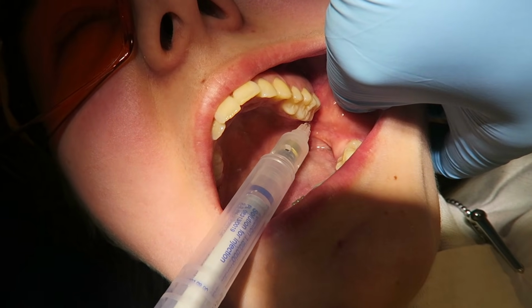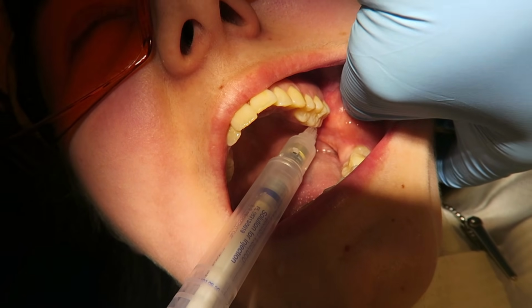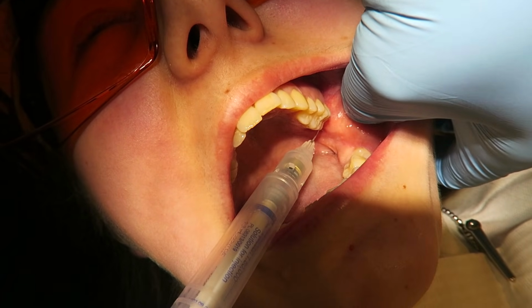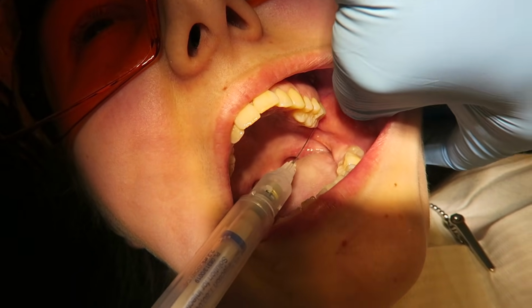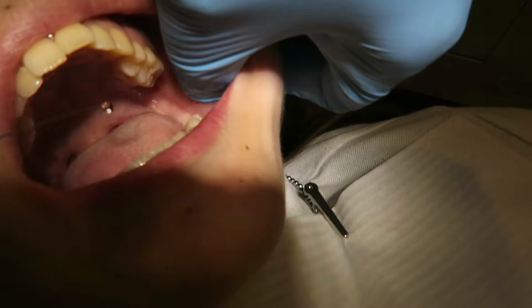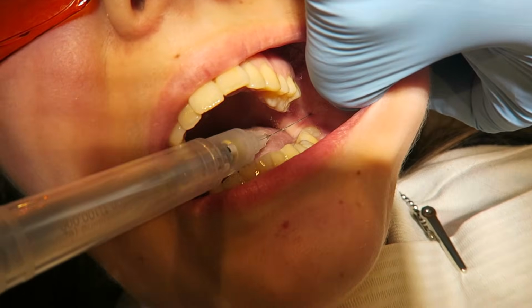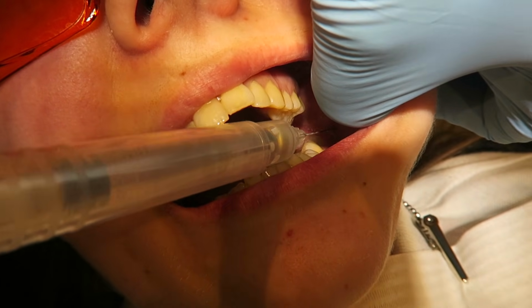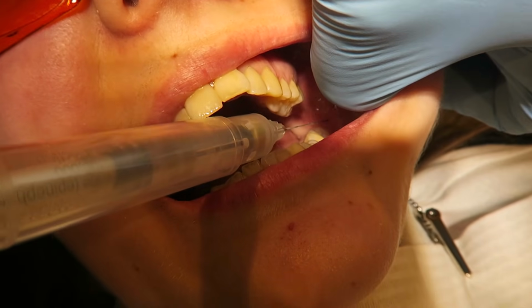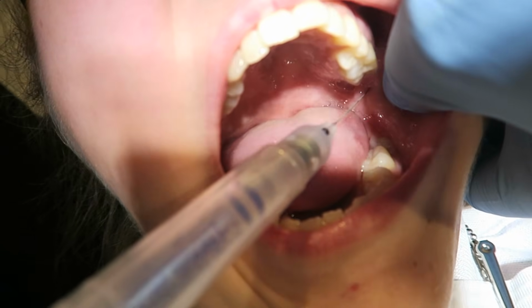So I feel for the bone, I withdraw a little bit, inject slowly for the ID nerve, and then I withdraw my needle about halfway for the lingual nerve. So that's for the ID nerve and the lingual nerve. Then the next step is to use another local anesthetic for the long buccal nerve. You can either do this by injecting distal to the tooth to be extracted, or along the external oblique ridge. A few drops will be more than enough, and then I go back to give another ID block.